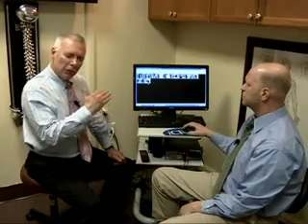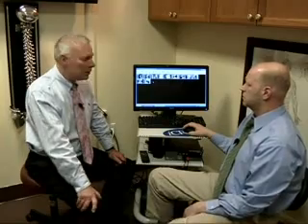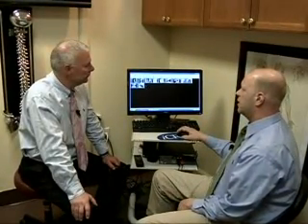After having that degree of imaging, I was able to say, listen, you're going to be in pain for 3 weeks, whether you play hockey or don't play hockey, and your foot is stabilized in the boot, and it's fine to go ahead and do that. So that's something that we would never be able to do without having that degree of clarity before. Non-displaced fractures are the most difficult to see because there's no displacement of the bone, and if you're not getting a good quality image, you can't see that.